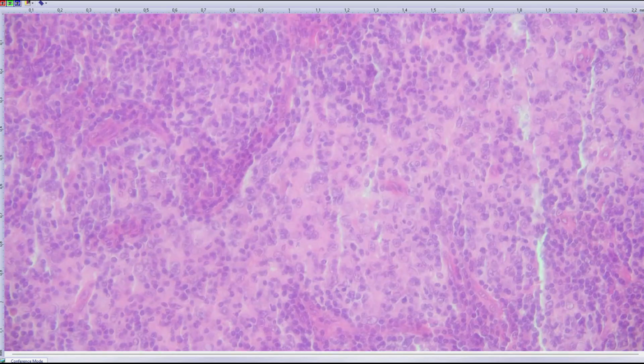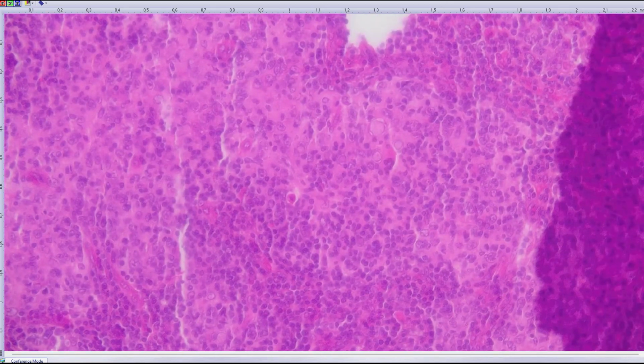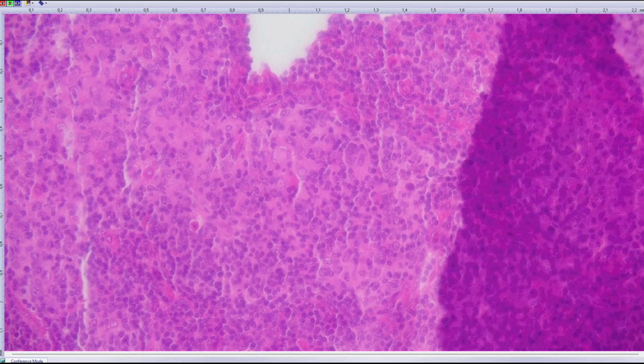Yeah, I do not see that. It would take me some time. You will see them in the middle. Can you see these intranuclear inclusions above the middle? No, they're in the middle. And these intranuclear inclusions are very typical of follicular dendritic cell sarcomas.